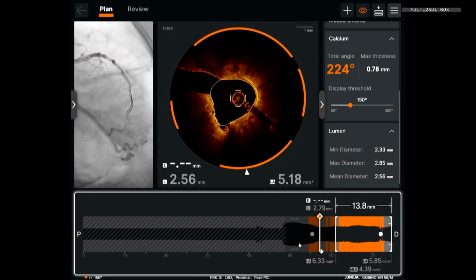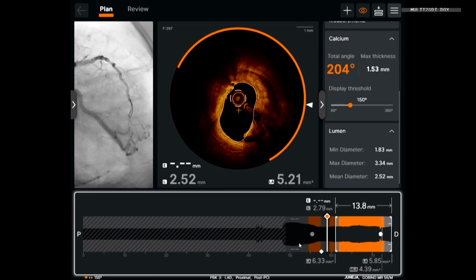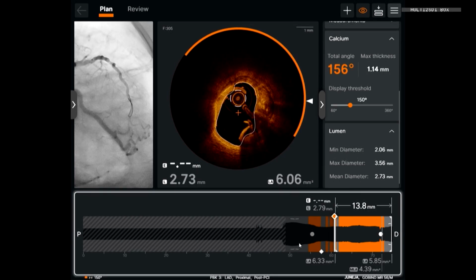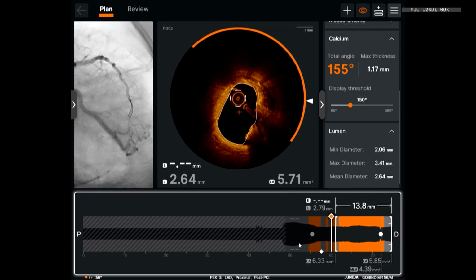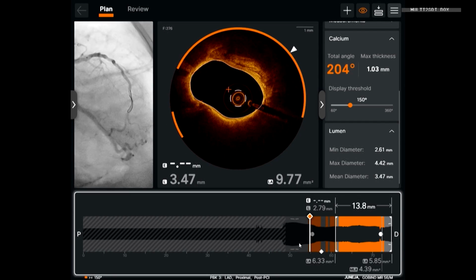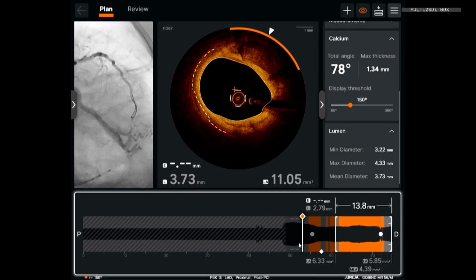We don't know if you did something offline. So what we are seeing is the OCT post-stenting and post-dilatation, or just post-stenting? No. This is OCT prior to this stent at the LAD ostium. We wanted to be sure whether left main distal is sound and healthy. So show the left main. This is left main distal, and it looked good to us.